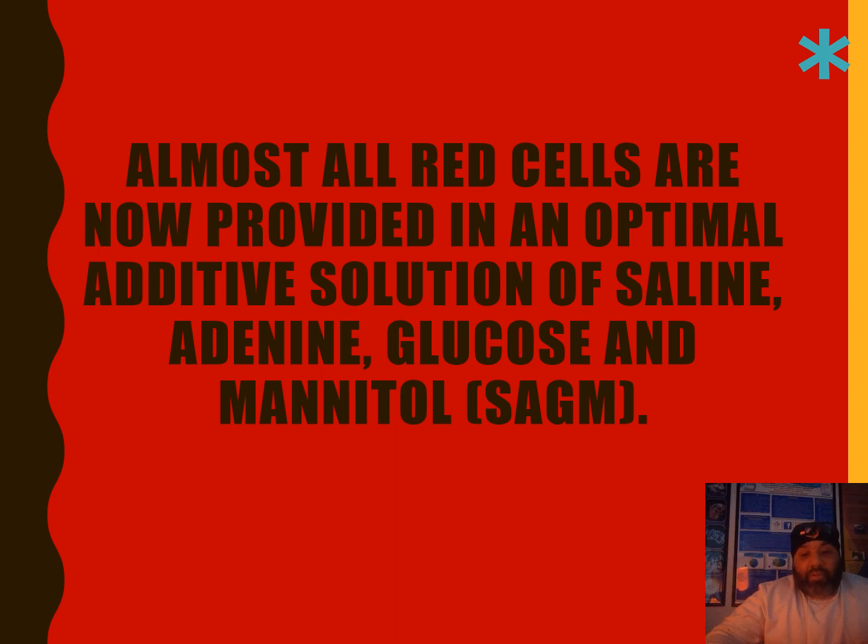Some laboratories refer to this as SAGM, and it's basically the bag of red cells that the components are provided in, and the additive solution is in that bag.